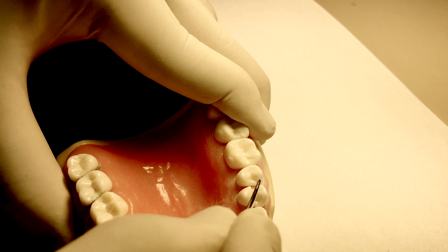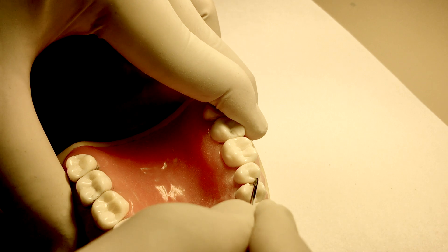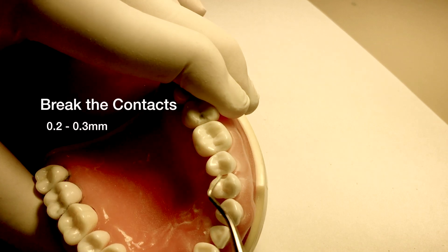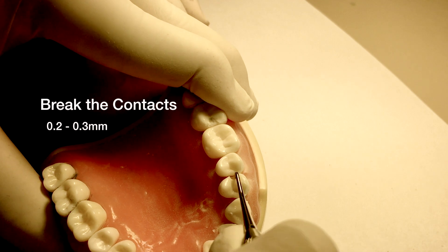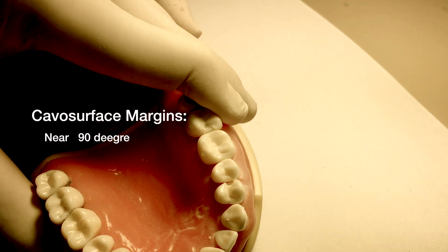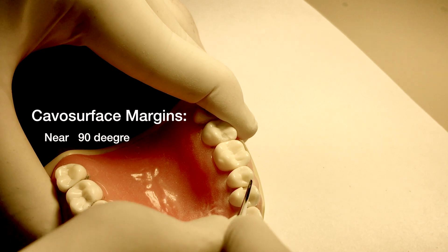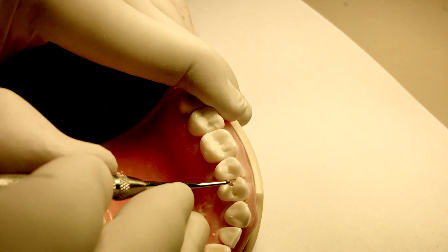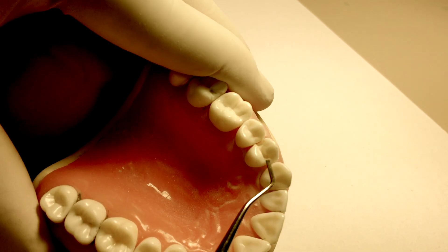Before extending into the proximal marginal ridge, visualize the final location of the facial and lingual walls of the proximal box in relation to the contact area. The contact needs to be just broken, 0.2 to 0.3 millimeters. The cavosurface margin should be nearly 90 degrees with no unsupported enamel. The walls in the occlusal portion of the class 2 should be nearly parallel or slightly convergent. The box portion should be slightly undercut to provide mechanical retention.